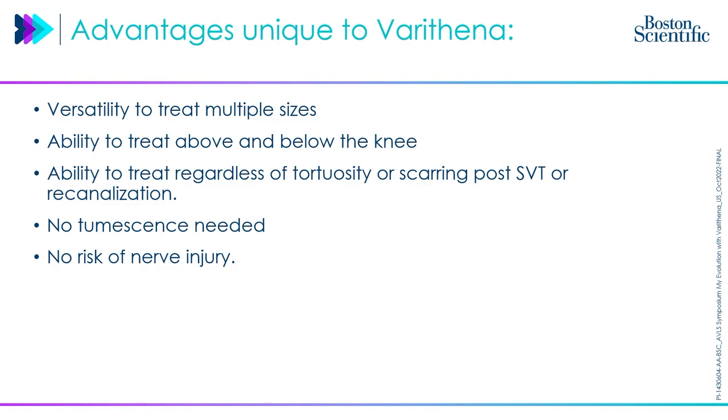I do once in a while use a butterfly, but I definitely elevate the legs before I go in with a butterfly, and this comes with experience. It's not going to stay in place if you put it in and then elevate the legs. You can absolutely assume 100% of the time that thing is going to come out. Your chances are you're going to be able to get it even if the legs are elevated, but I wouldn't try it before elevating them. It's just not stable.